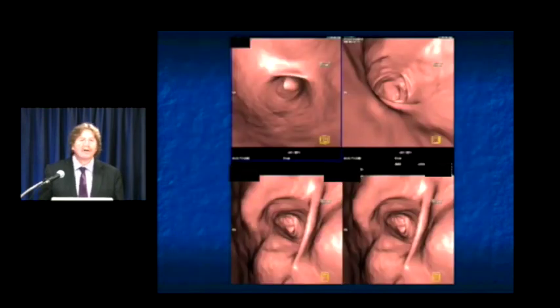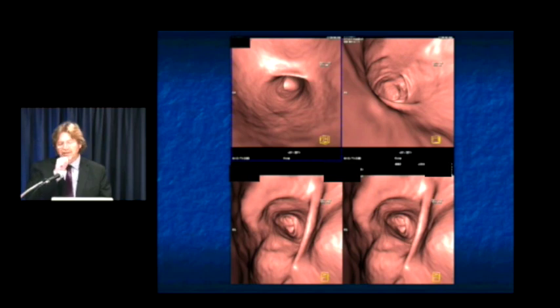We talk about virtual colonoscopy. Virtual colonoscopy works very well. Its accuracy is the same as classic colonoscopy, but it's not been as widely accepted. That's because the people who refer to colonoscopy are the ones who perform the colonoscopy. So it's really not been used all that much.